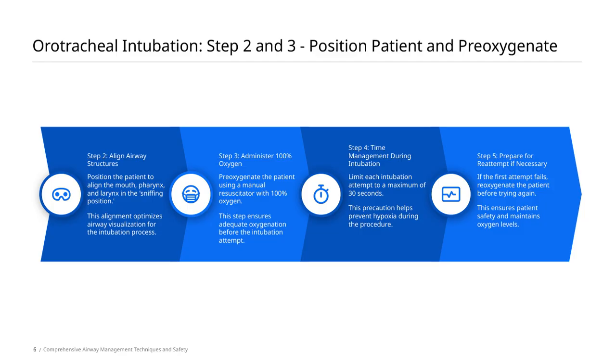Remember, if the first attempt to intubate isn't successful, it's important to reoxygenate the patient before trying again. This reoxygenation maintains their oxygen levels and safeguards their safety during the process.